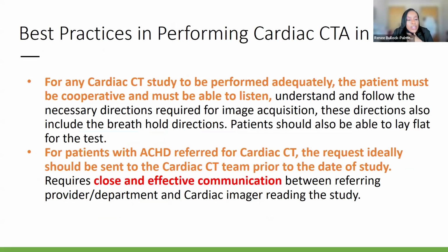So, for the study to be done adequately as well, you want to make sure that the patient understands what the study entails. You explain to them what's happening, and of course, they should be able to follow the instructions. In some of these patients that we image, they may have mental challenges. It's very important sometimes that you may have to even have the relative close by, not in the room, but of course, close by on the day of the scan to calm them down. Sometimes you may have to give anxiolytics as well.